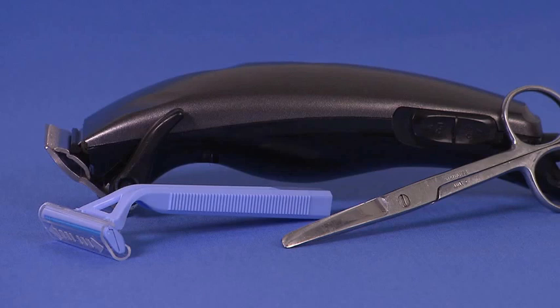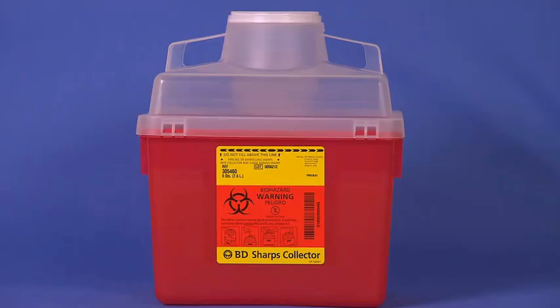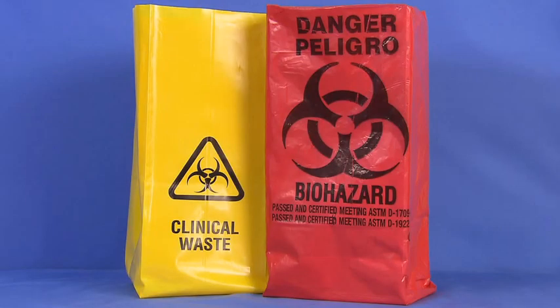Other equipment may include scissors, electric clippers or a razor if hair removal is necessary. Disposable drapes, a biohazard sharps container, and biohazard bags — while these come in various colors they can be identified by the universal biohazard symbol. Please check your institution and state regulations to confirm which bag is used.